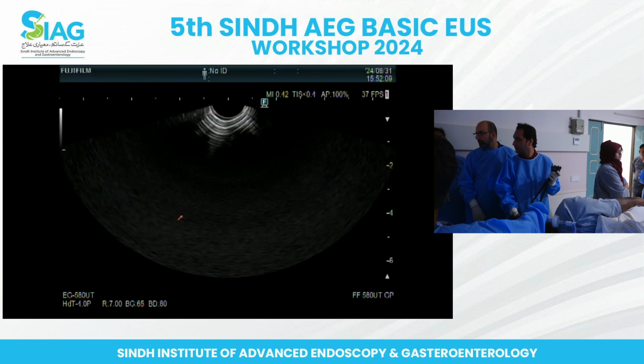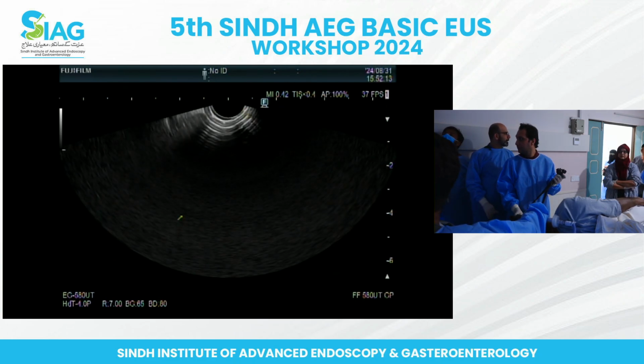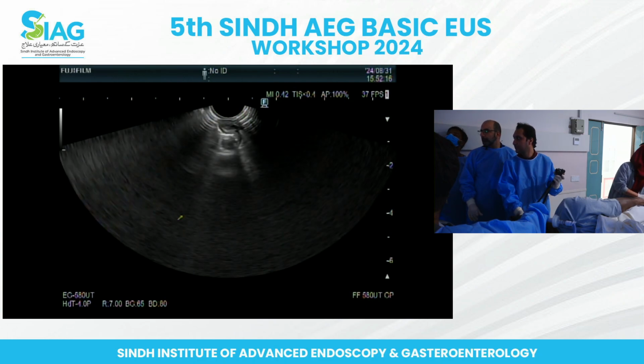Mr. Bhai, we can't see the endoscopic image. Can we have both EUS and endoscopic image? Yeah. They're working on it.